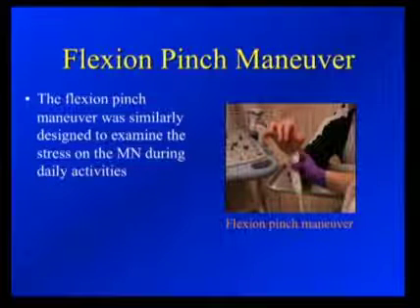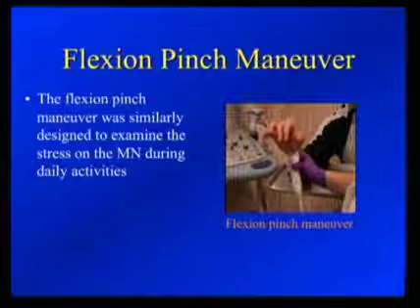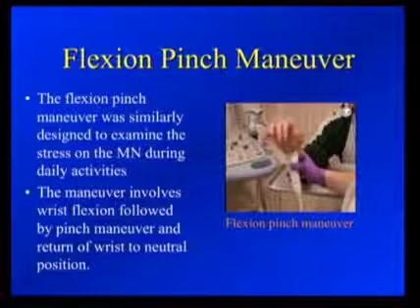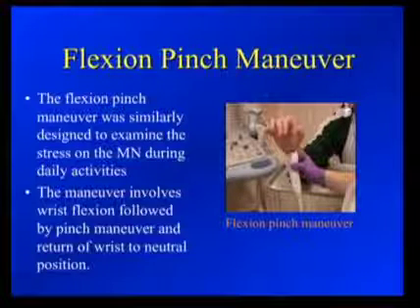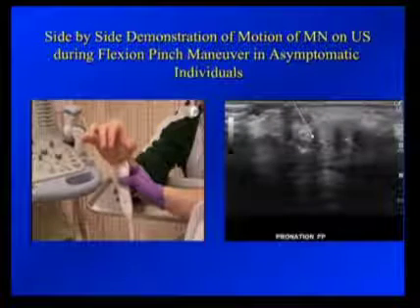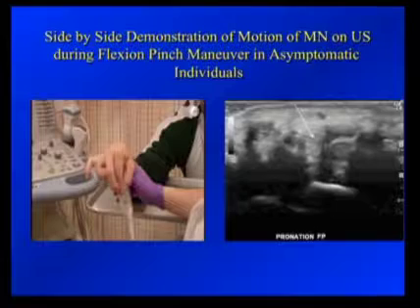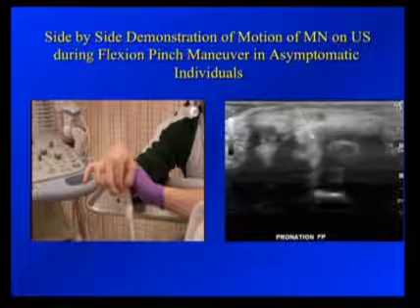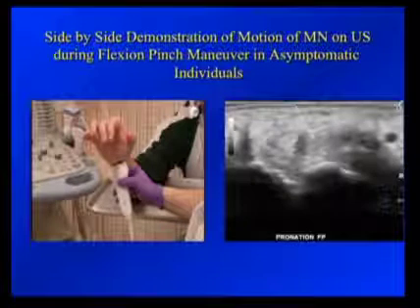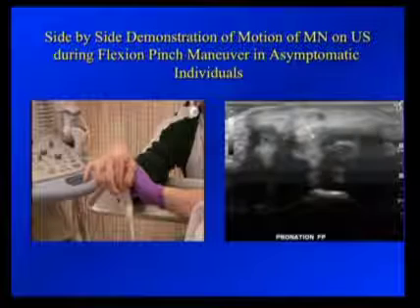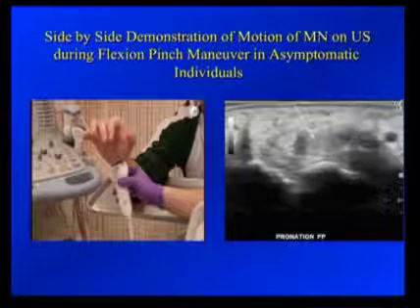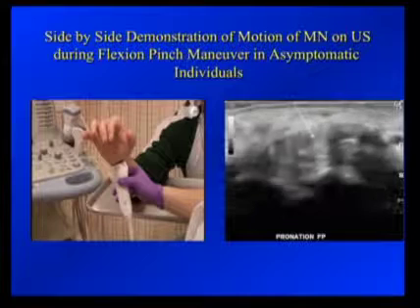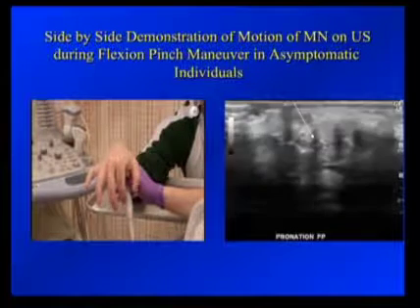The next maneuver we now routinely use is the flexion pinch. That maneuver is done with the hand in pronation, holding for about two to three seconds, then releasing and returning the wrist to neutral position. When an individual does this, most of the time there is indeed some sagittal movement of the median nerve relative to the carpal tunnel, even in asymptomatic individuals. You can see the movement of the median nerve into the carpal tunnel with the flexion pinch — the nerve moves sagittally in the carpal tunnel and then moves back out. Sagittal movement of the nerve is quite common in flexion pinching.